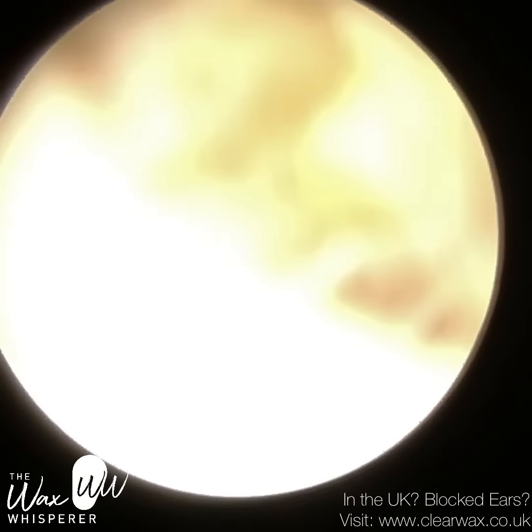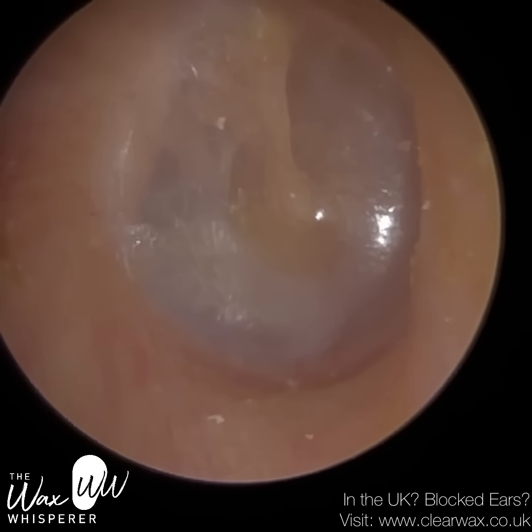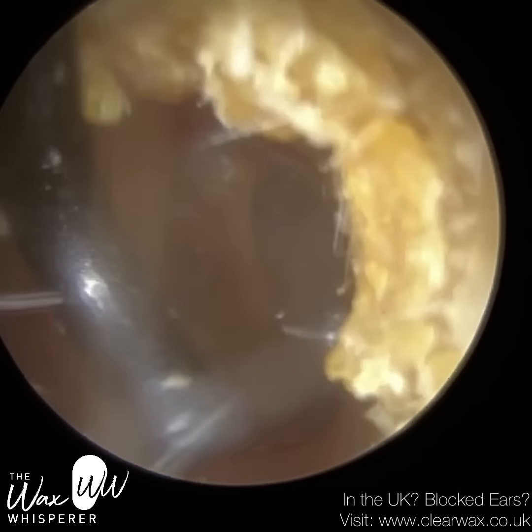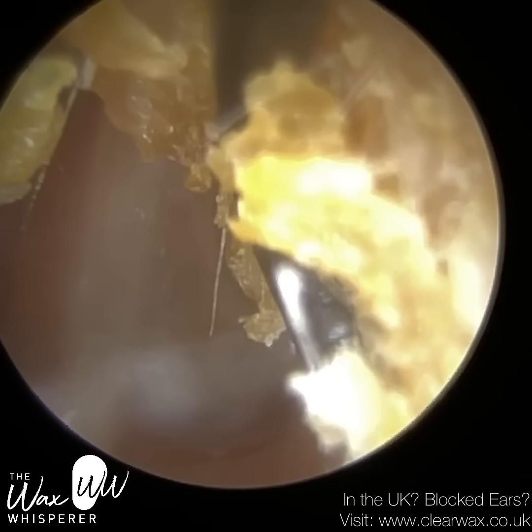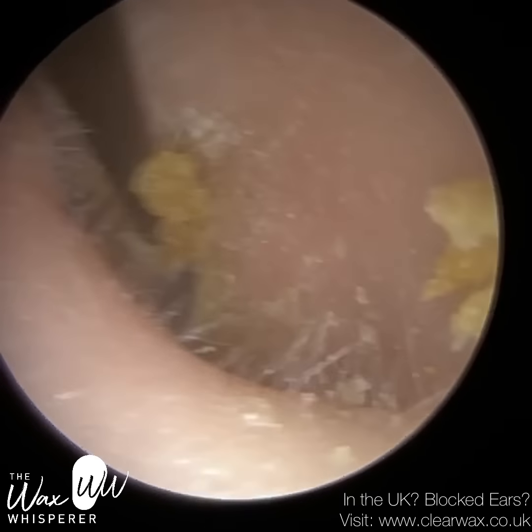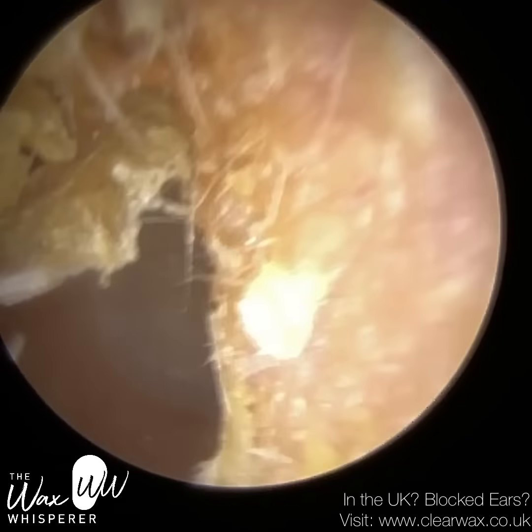So because we're close to the skin, because it's near the entrance, but also because of the reflective properties of dead skin and the protein keratin that's contained within skin. So you can see I've removed that plug of dead keratin quite easily, less than a couple of minutes. But this patient's got a layer of skin that's lining the ear canal. Now, with a child age 14, it can be difficult to perform a skin peel because they're not always the stillest of patients, naturally of that age. But this patient's been brilliant. It's been coming for many years now, and they're very, very still.